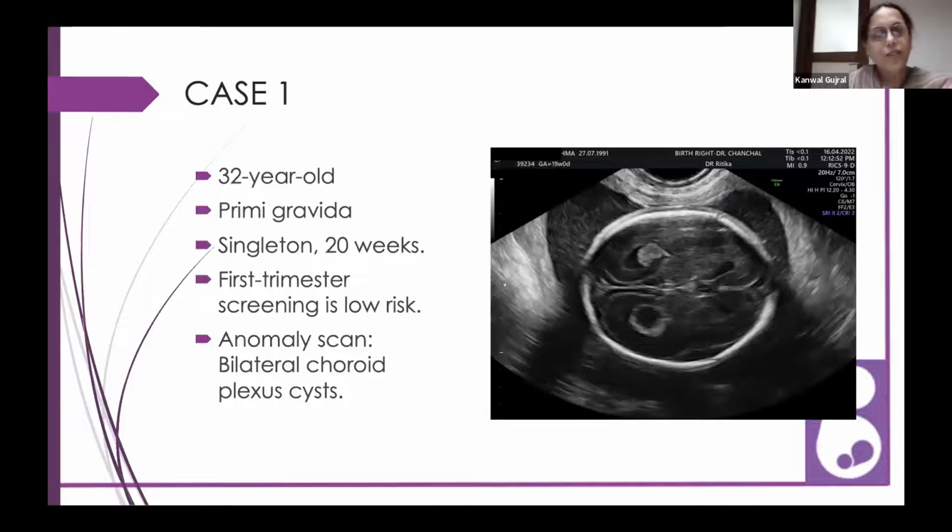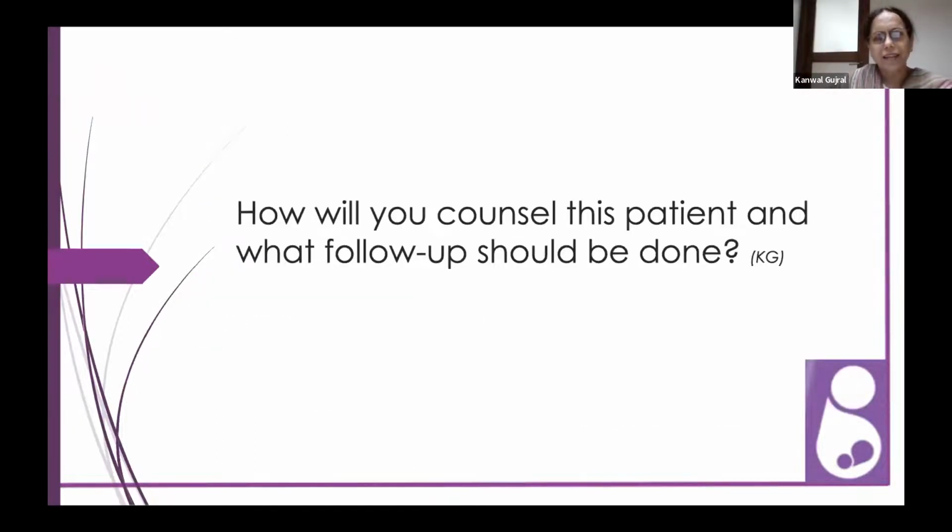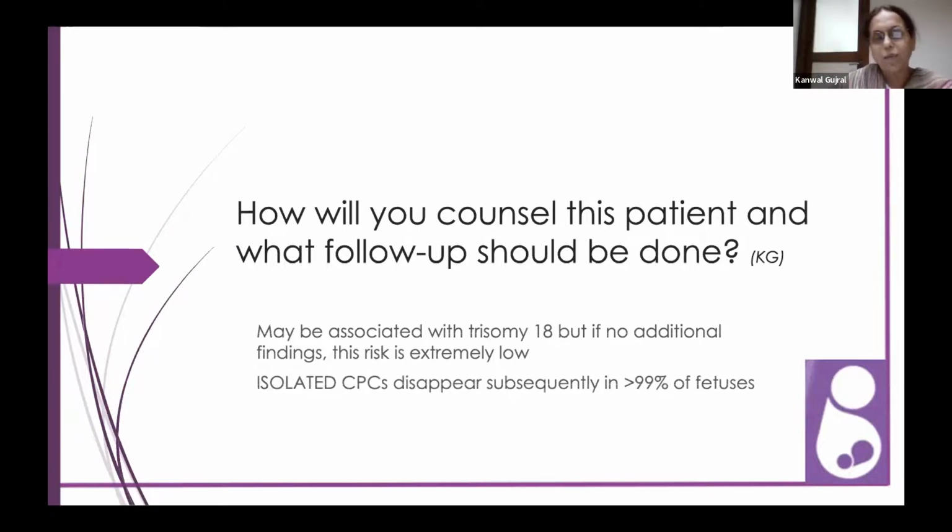Thank you, Chanchal. Good to see you again. We all know, and at the Fetal Medicine Forum we know, these are benign things. If the first trimester screen is normal, there's no other associated anomaly on a good ultrasound, and there's no bad obstetric history. We know it has some association with trisomy 18, but we do not see any criteria with a normal first trimester screen. We take it as a finding that 99% will go away by 26 weeks. Standard obstetric care, standard timings for the ultrasound, nothing special, and the same for delivery.